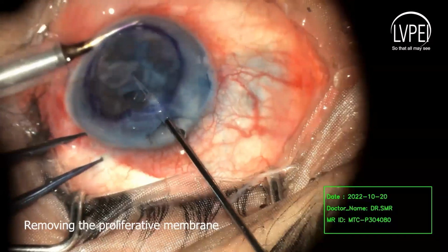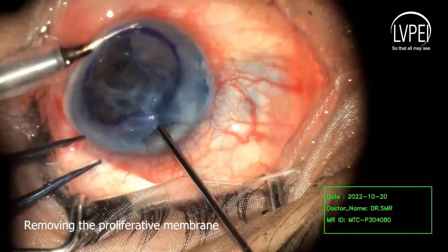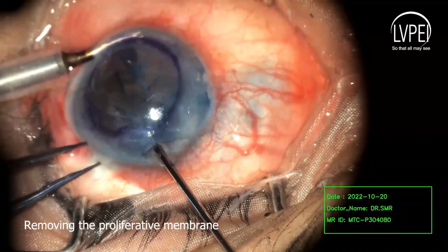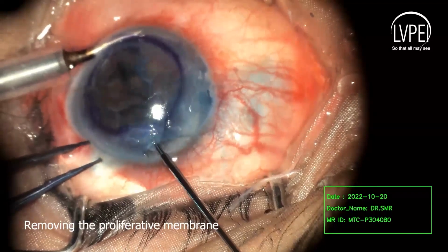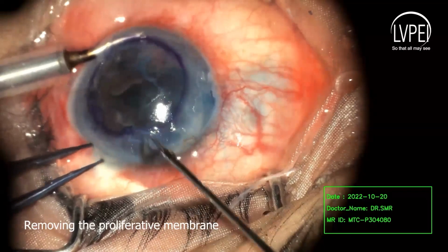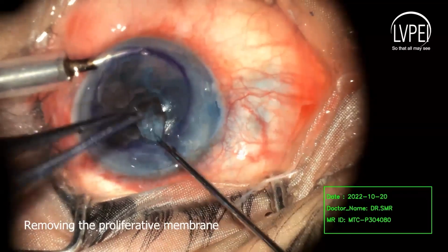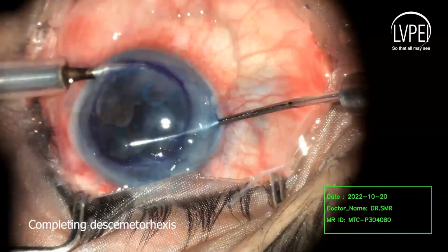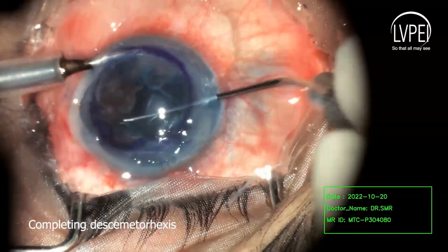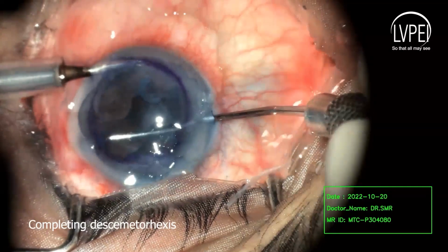A 5 mm limbal wound was constructed. The proliferative membrane was removed using micro forceps. The Descemetorhexis was completed along with release of synechiae.